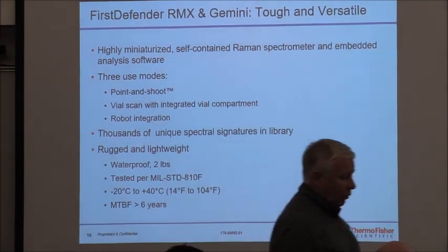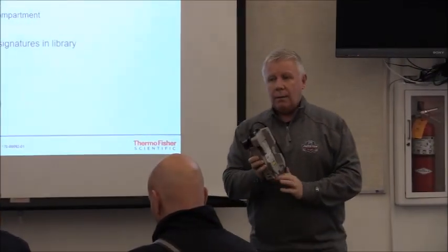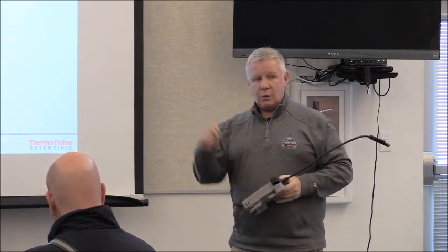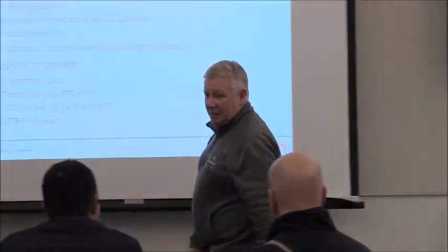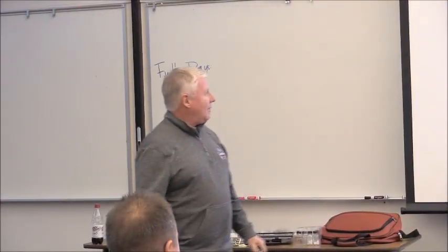The only way you're really going to damage these, unless you truly try, is don't do this. Don't take the probe, wrap it, and then walk holding and swinging the probe. These are fiber optics. You will eventually pull the fiber optics out. And I have seen guys do that. I've seen them walk and swing the device around and stuff. What's 60 grand? It's okay. I've seen a lot worse.